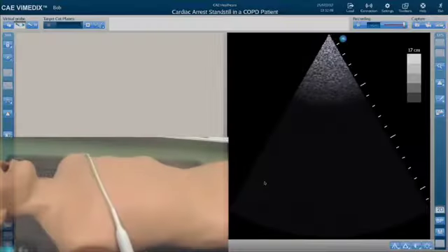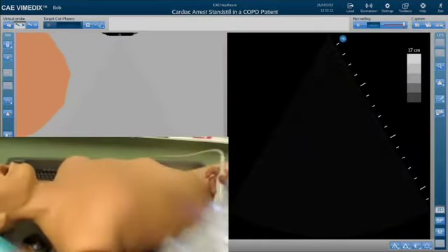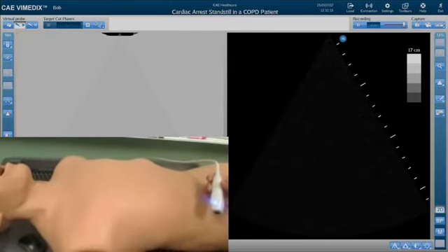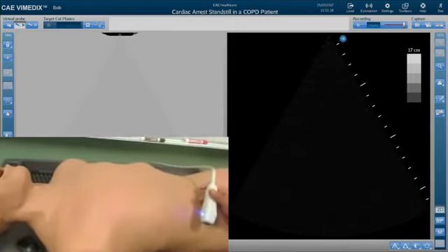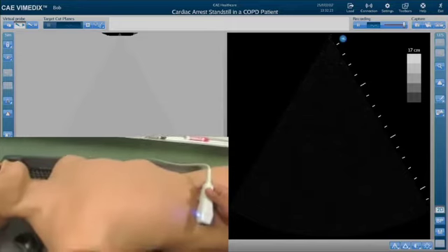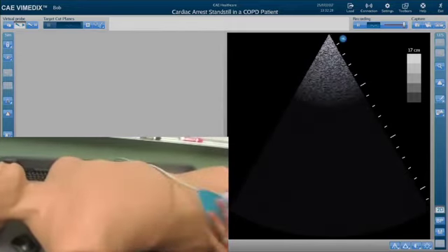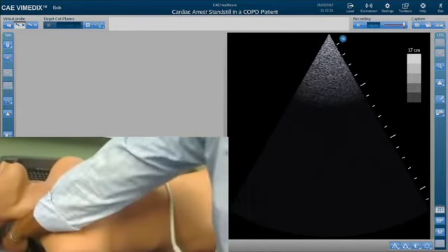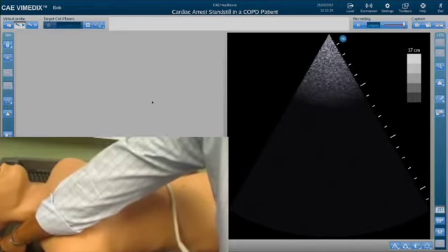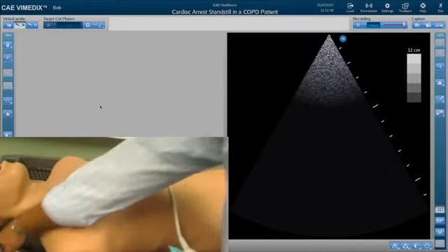Okay, so now we're going to go into the section of pulmonary ultrasound to evaluate for airspace disease. The examination is actually the exact same probe placement that you do for examination of the lung pleura to evaluate for pneumothoraces, but now we're using the lower frequency probe to allow for deeper penetration, and you're going to adjust your depth on your ultrasound machine to be able to visualize at least 10 centimeters into the lung parenchyma. Here we'll put it at 12 centimeters.